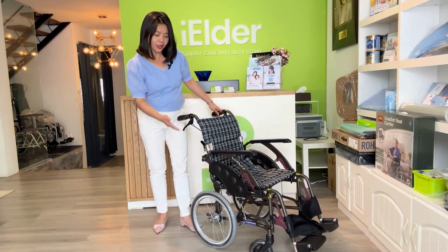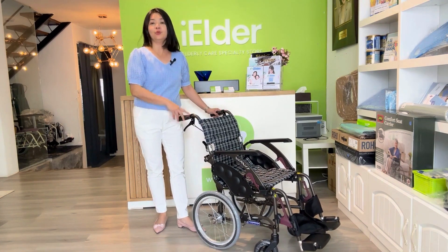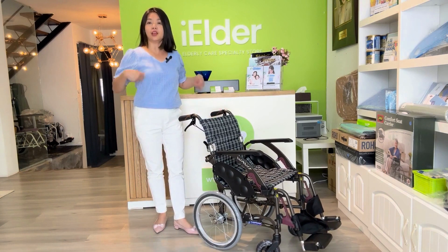Why do they call it 16? Because the rear wheel is 16 inch. And we have another model which is 22 inch — it's a self-propelled version.